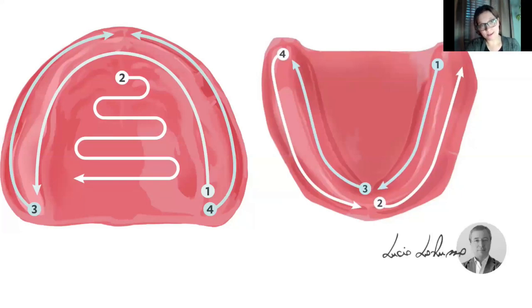Certainly you can scan the intraoral tissue, and this is becoming a more and more common workflow. Lucio LaRusso worked with 3Shape and came up with this scan path pattern. This was the first documentation, the first validated workflow for an intraoral scanner to scan soft tissue.